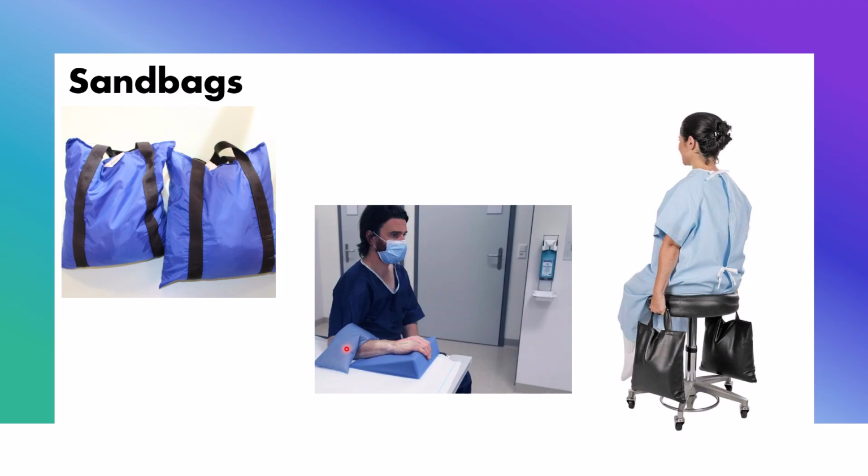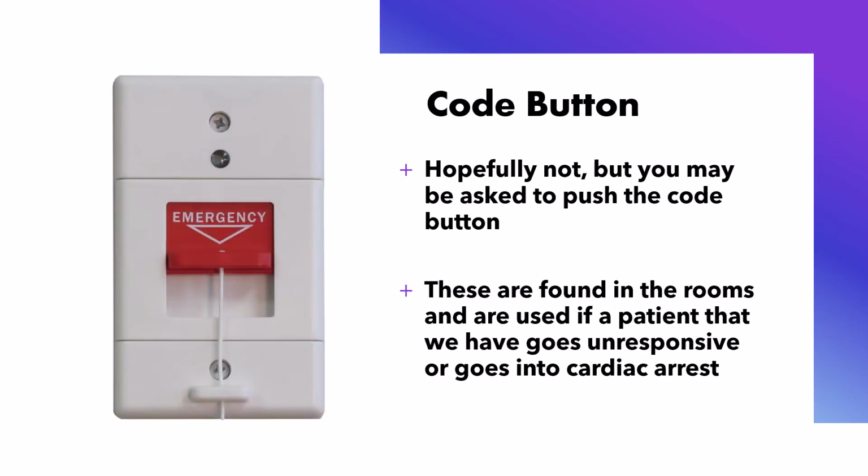You also can use a sandbag to help you hold a patient in position. If you have a child, you can put a foam wedge here and then put a sandbag beside it that will help keep the child from moving. Or if a patient has trouble holding their arm or leg still, you can use a sandbag for immobilization.